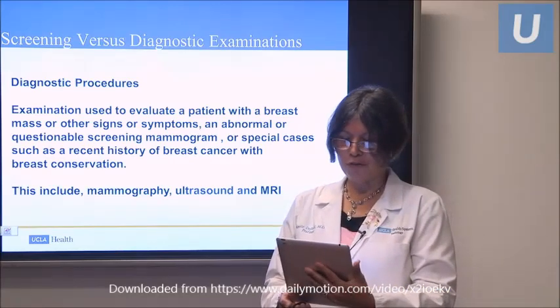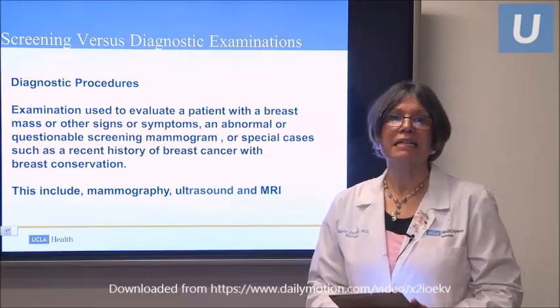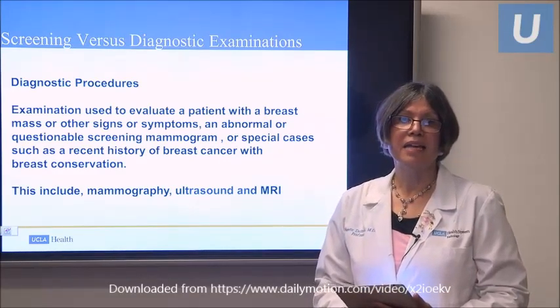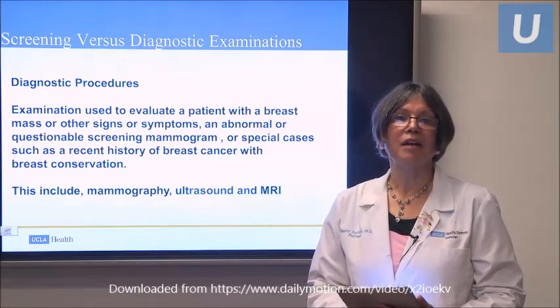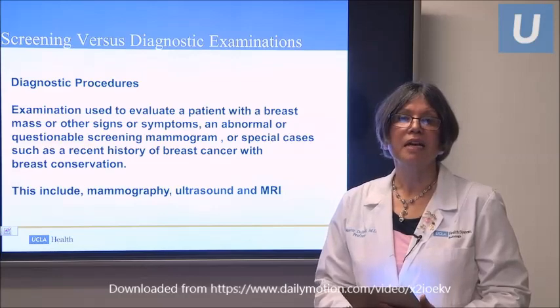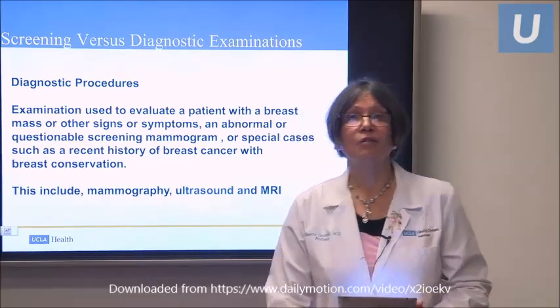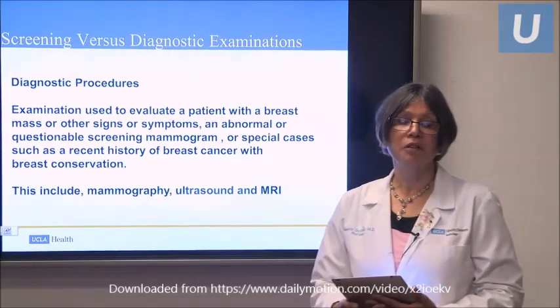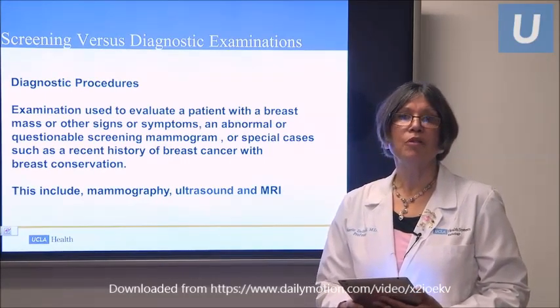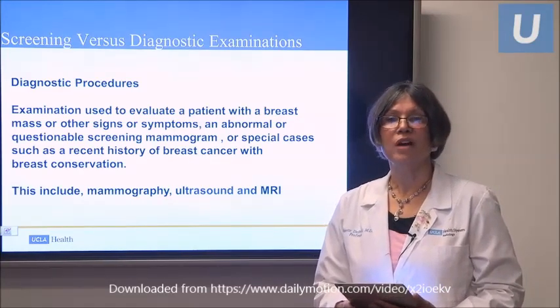How should I prepare for a mammogram? Well, I can tell you that the best way, certainly for women who are premenopausal, is to have the mammogram done maybe the week after you've had your menstrual cycle, so that the breast would not be so engorged or painful. And if you do have painful breasts in general, what I would recommend is that you take some ibuprofen or Tylenol before to reduce the effects of the compression.